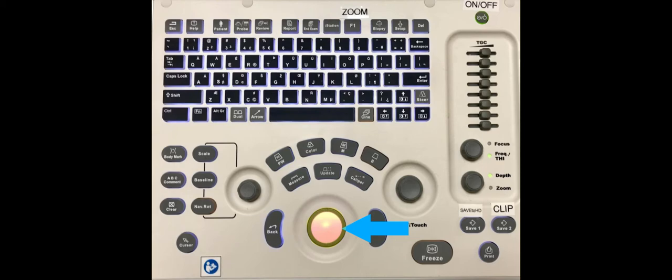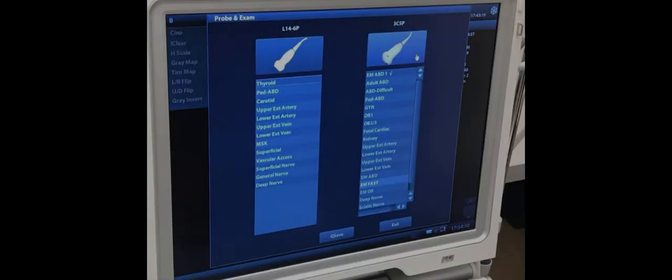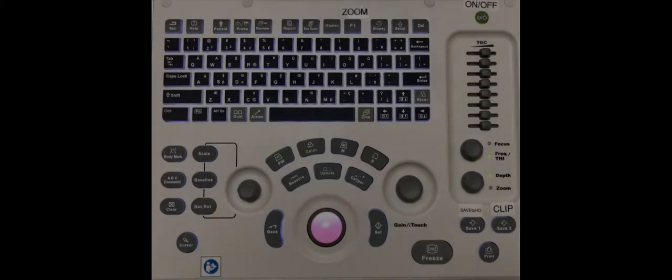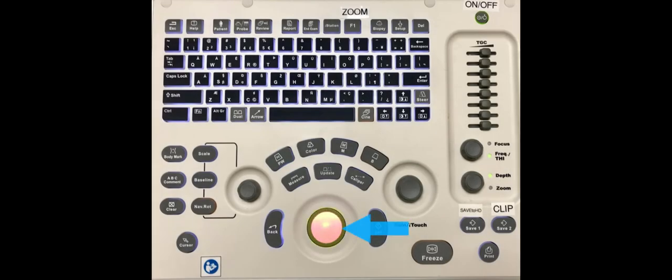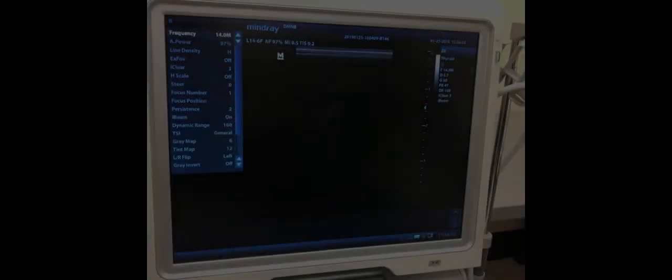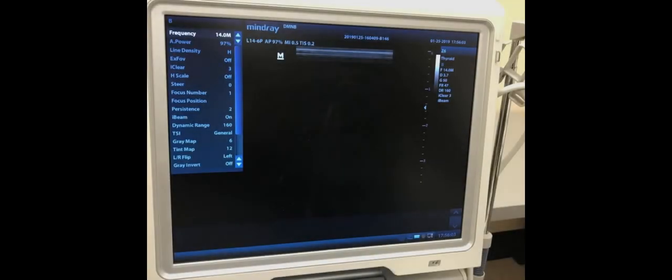Note that most machines will have a number of generic settings that can be used for a list of specific applications. In this case, we are going to choose the thyroid setting. Using the trackball mouse, move the pointer over thyroid and then press the set button. Note that the set button on this machine is equivalent to the standard left mouse button. The screen will now look like this, and you're ready to start scanning.